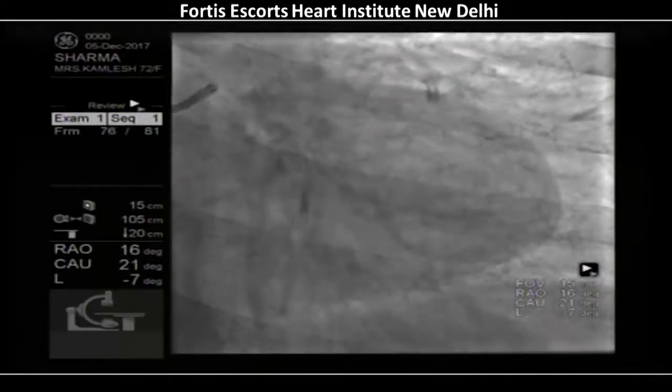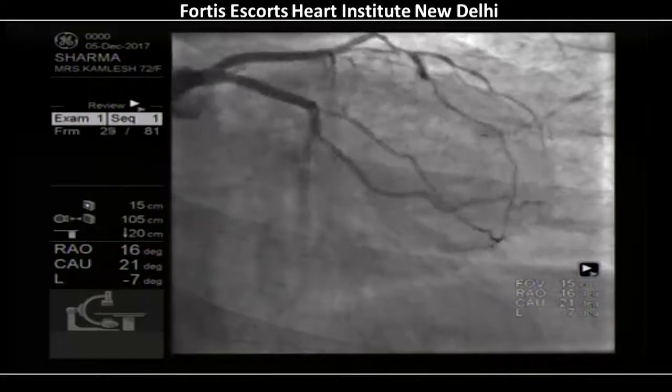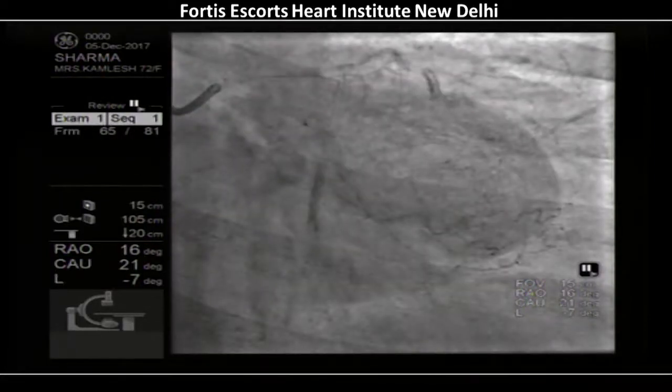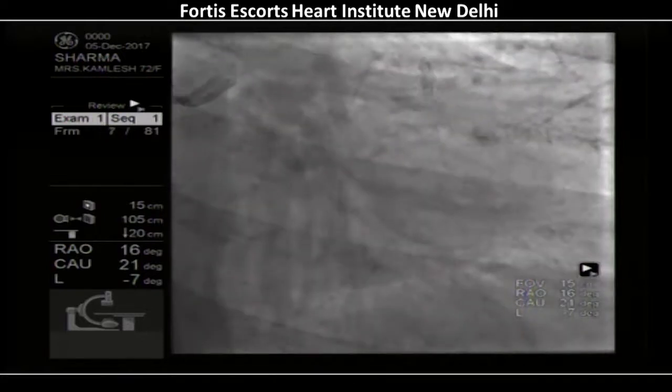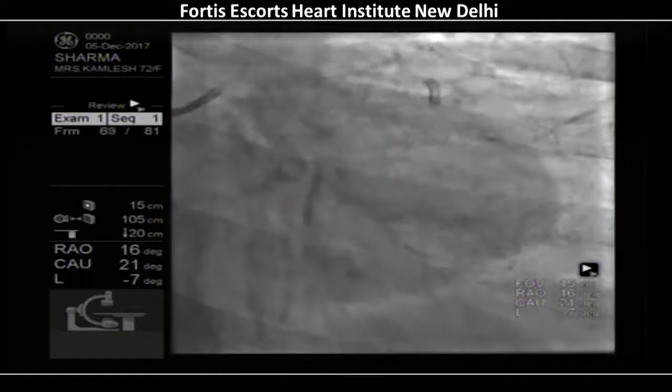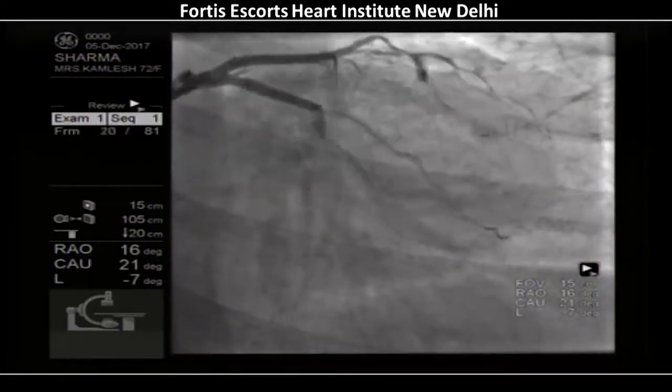I think watermelon seeding, dissection is one. I have seen somebody like this with multiple vessels actually have spasms as well with the acute ST elevation MI. Couple of times she presented with ST elevation MI. So obviously we are going to give nitro, to see.